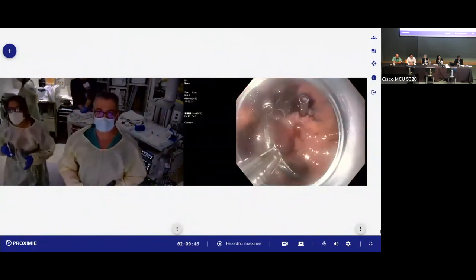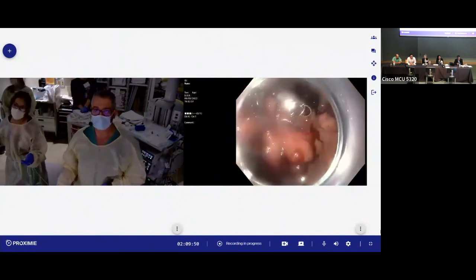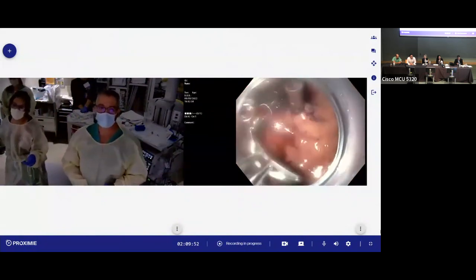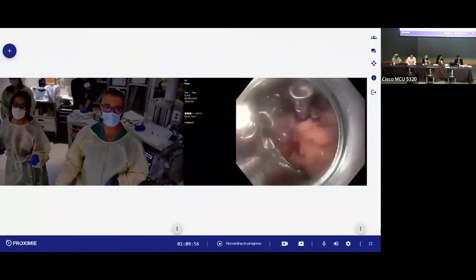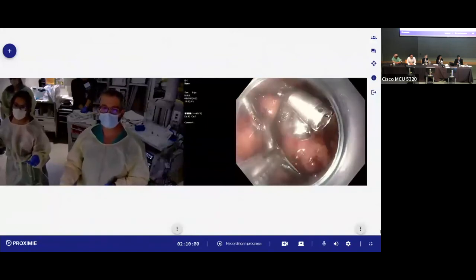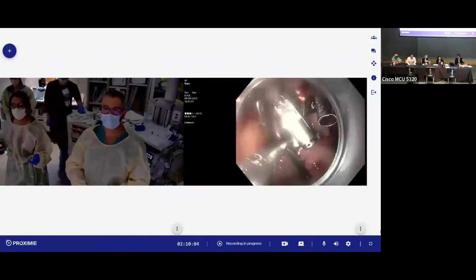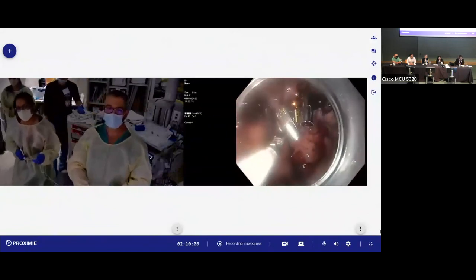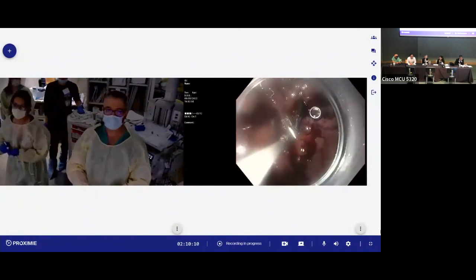This time we'll go, yes, exactly, perfect, 11 to 5. And we'll try to go in between these clips. And this one, it gets even harder. All right, now we are there. So in between again, there. Hold this position. The control of the scope is very impressive, and he's making this look very easy.